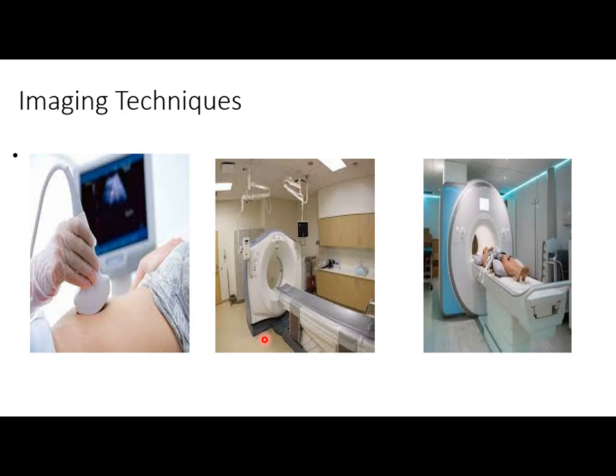Basically, the CT protocols are: 30 to 40 seconds after contrast injection for the arterial phase, to exclude active bleeding; 70 to 80 seconds, the portal venous phase, for most pelvic complications like abscess and hematoma; and a little more delay, like 100 to 120 seconds, for thromboembolism and thrombophlebitis.